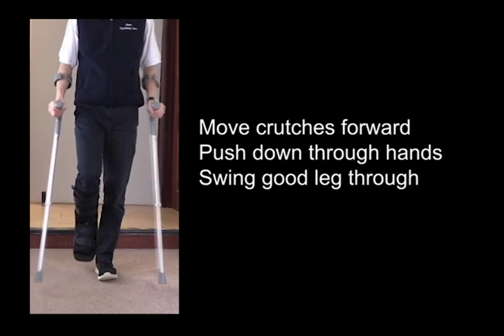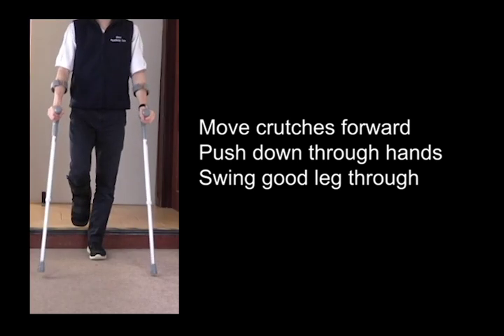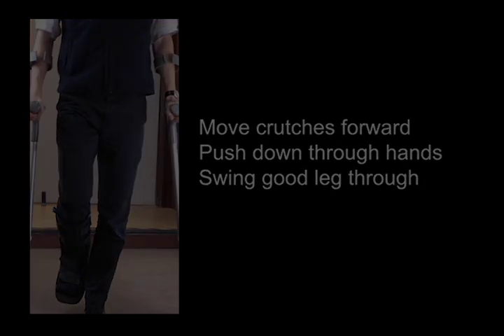move the crutches a short distance in front of you, press down firmly through your hands and swing the unaffected leg through. Your foot should end up in front of the crutches.